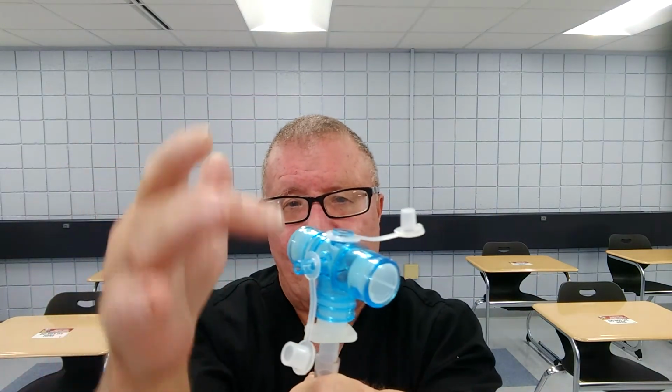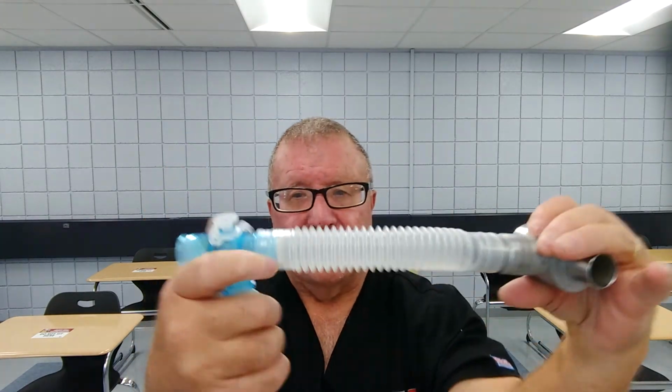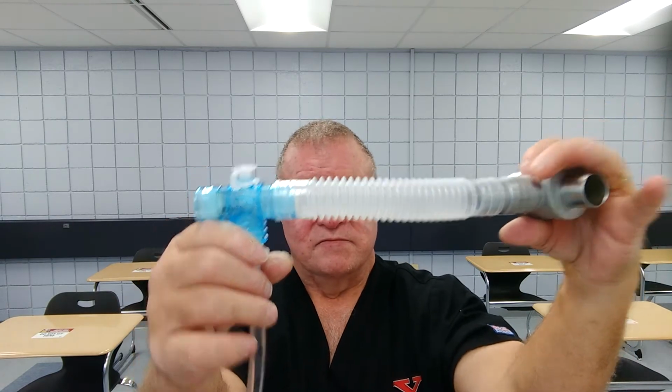It's hooked onto the endo tube. These two ports here are closed off. Those are used for other tests that you can perform. The outside is attached to your large bore tubing here.